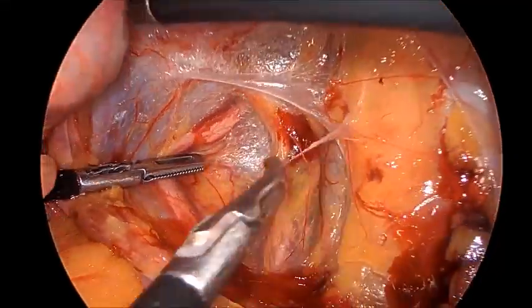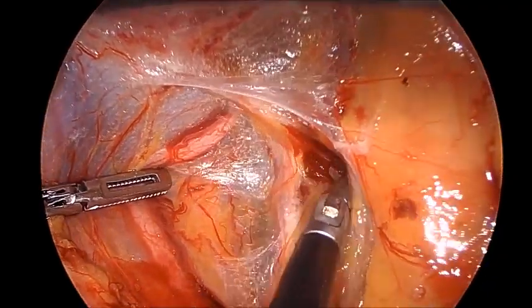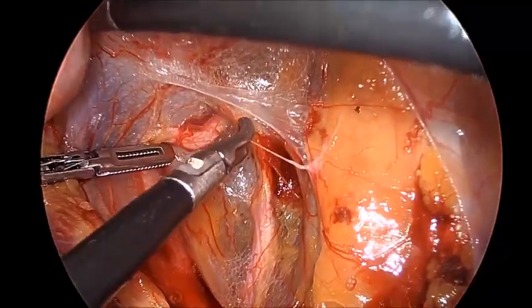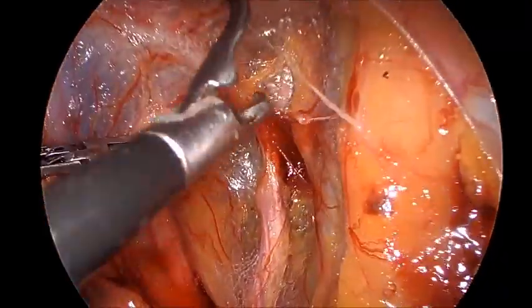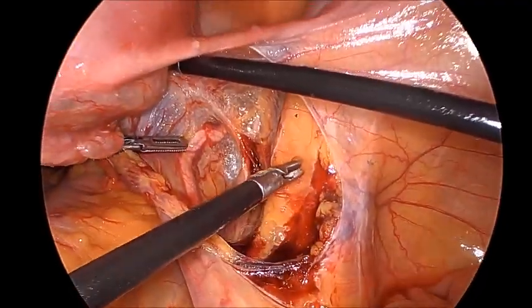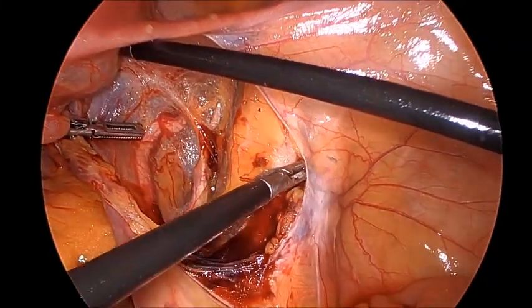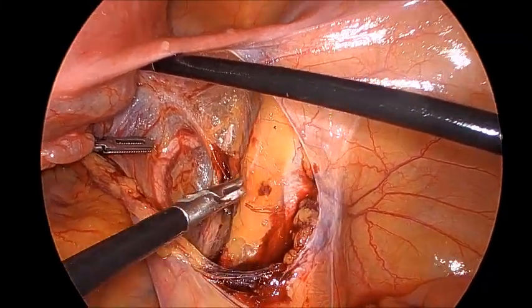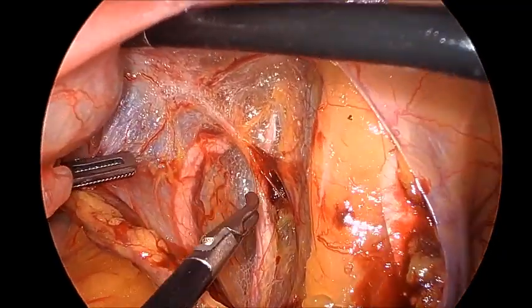Once you have identified the ureter, you medialize it with the atraumatic grasper, and then we have to dissect further to identify the internal iliac artery branches. What we are seeing here is the anterior division. The first medial branch of the anterior division of the internal iliac artery is the uterine artery.